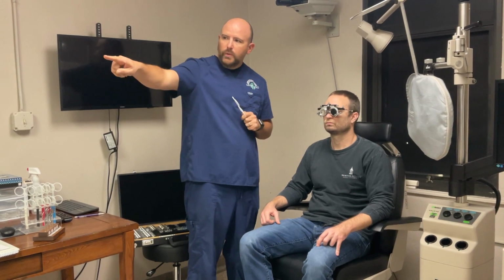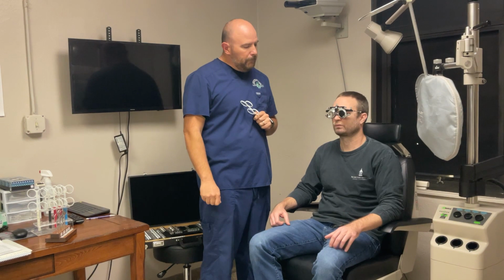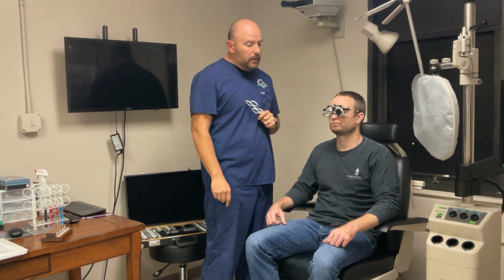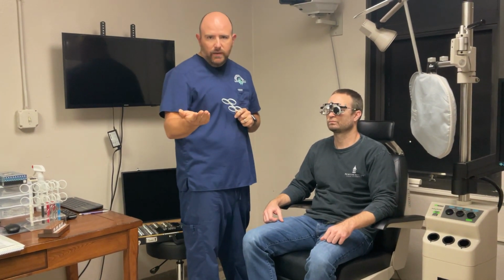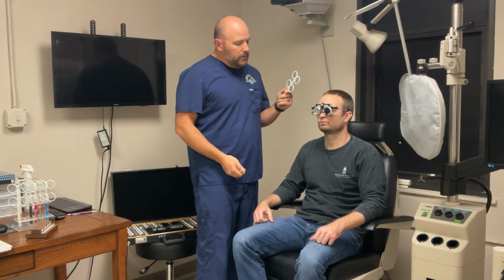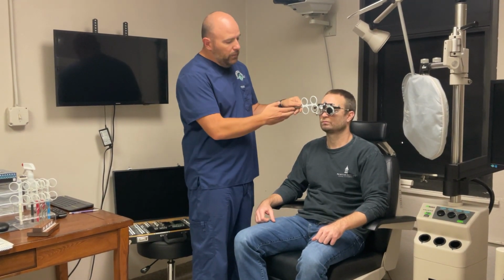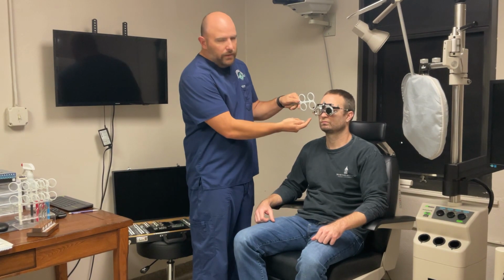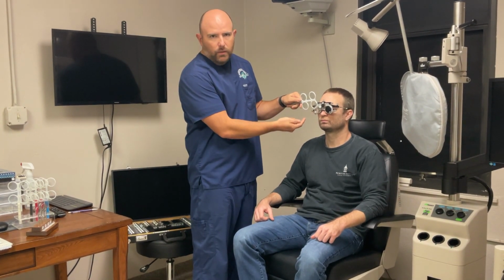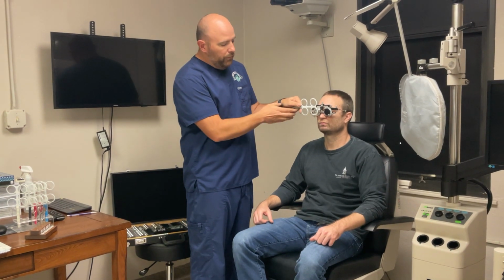And so now, Drew, I want you to look at the line that says NVSOK. Are you able to see that? Yes. You can look at any letter that you like. You don't need to select a specific optotype for the final sphere, but you do need to have them one line above best entering acuity, okay? So now with this one, we're not going with or without. We're going to keep the lens in front of the patient all the time because we truly don't care about this minus 4 that's here. What we want the patient to do is look through the 2 lenses that we're showing them through the flipper.